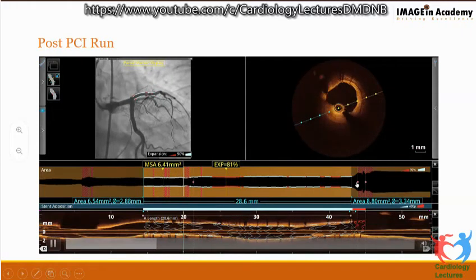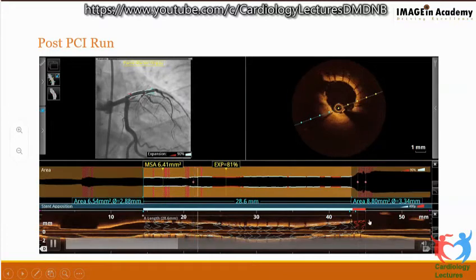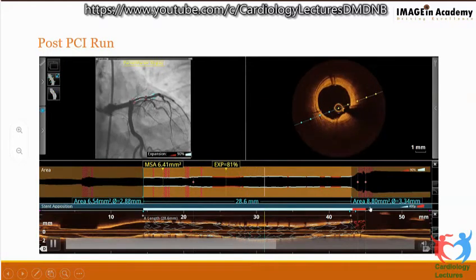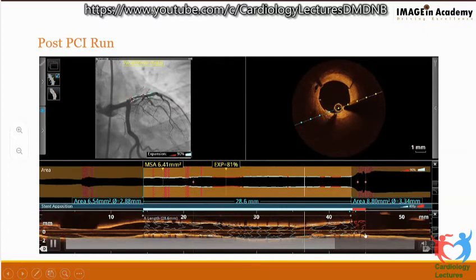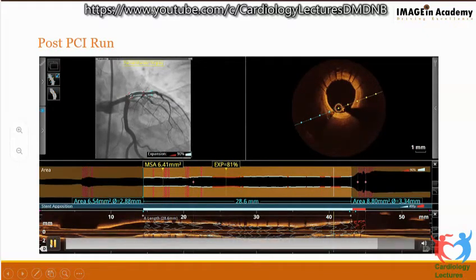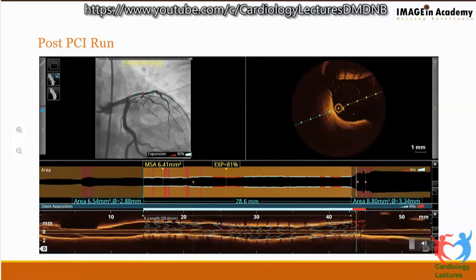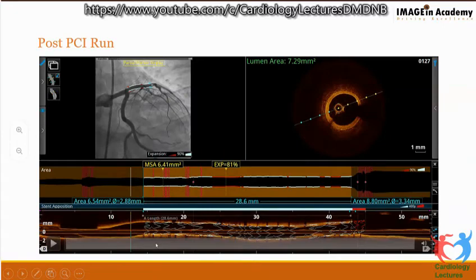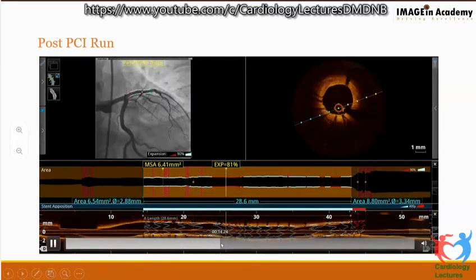Now, why has this happened? Probably because the stent has encroached on the segment where there are side branches, or in this case, we've come onto the segment where there is either a diagonal or the circumflex origin. This is the left main segment. So that is how it gets marked red, and the apposition shows that at this point. I will stop it here and I'll show you. Sorry, at this point, it's gone to the previous slide. Let me get it here and I'll show you.